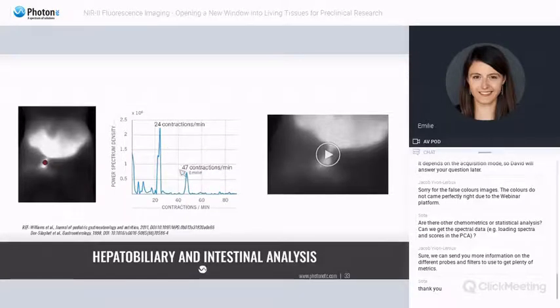So one around 47 contractions per minute and another one around 24 contractions per minute. And actually the one at 47 agrees quite well with what we found in the literature for the contraction rates for peristaltic movement. And the one at 24, we don't know exactly what it is, but there could be some interesting science to study here to try to find what's happening.